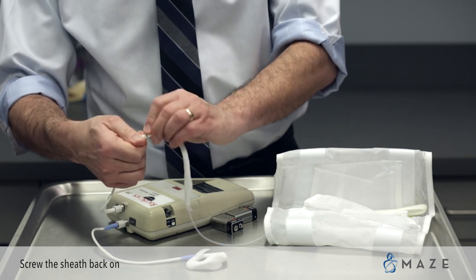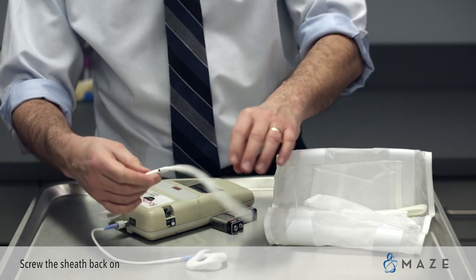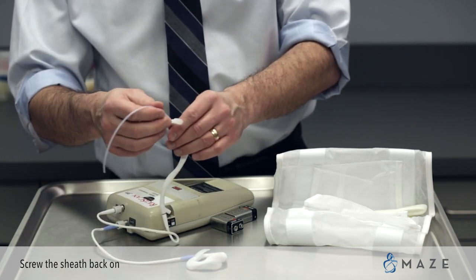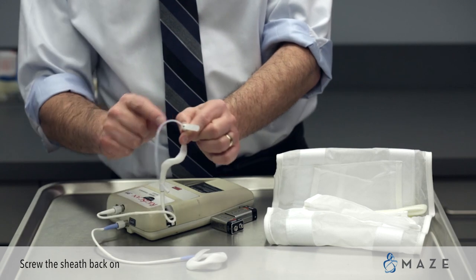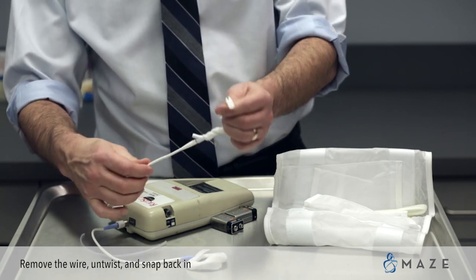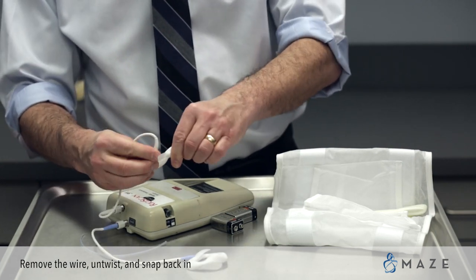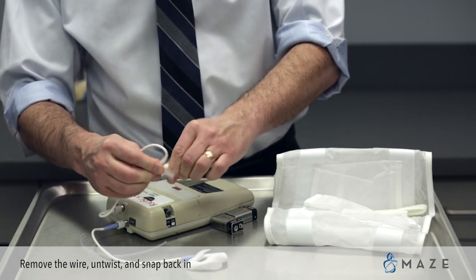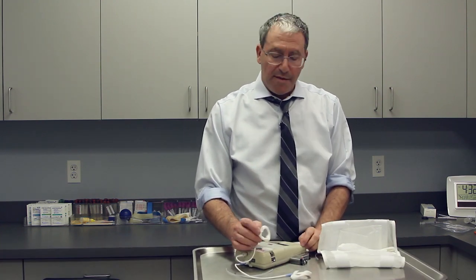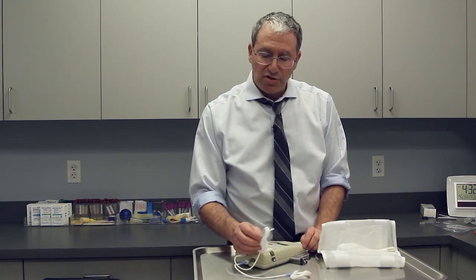Remember the little L — or Y — is sitting closest to the machine. Gently pop the top through, remove the guide wire, untwist, and just push it in. Then you're ready to start again. It is not uncommon for that to happen, and of course it takes a little bit of finesse, but you should have no problem restringing it.